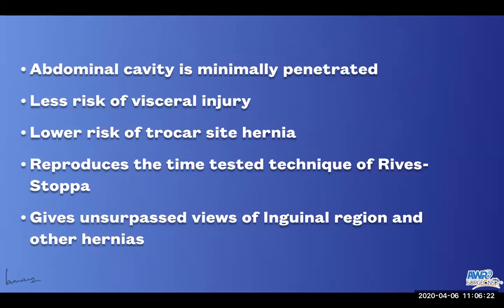If you're an inguinal hernia surgeon using eTEP, once you divide the arcuate line for a couple of centimeters, that whole space opens up and gives you a phenomenal view of the myopectineal orifice, and you can actually put in bigger meshes and have fewer recurrences.